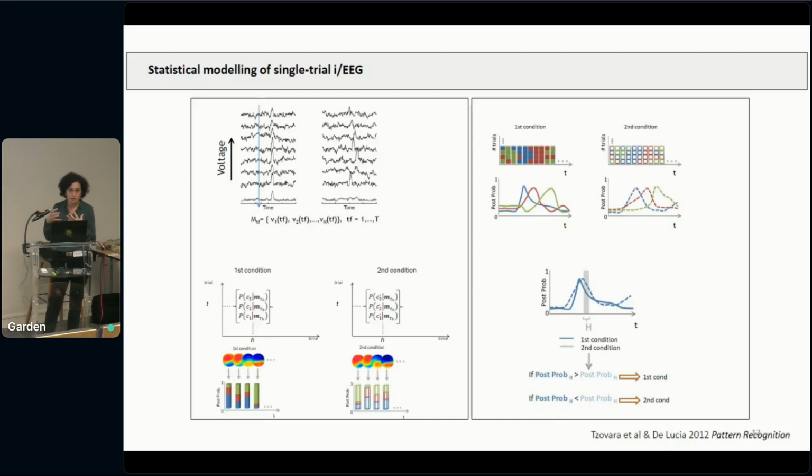At the end of all this, essentially, we have a decoding accuracy, which tells us how well, at the brain level, the single trials that we record give us information of the different patterns in response to sound type. And what you see in the following slides is the area under the receiver operating curve of this decoding performance, which is a proxy of this auditory processing in response to these regularities.